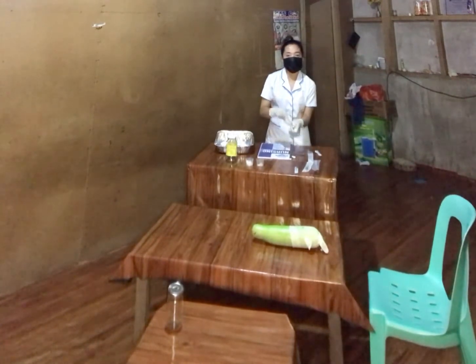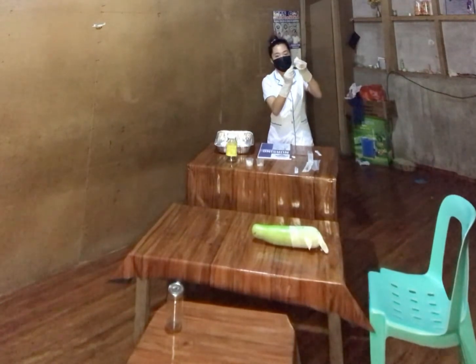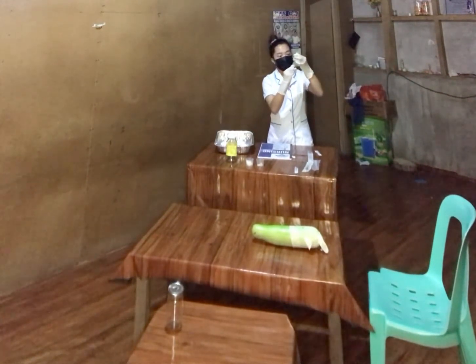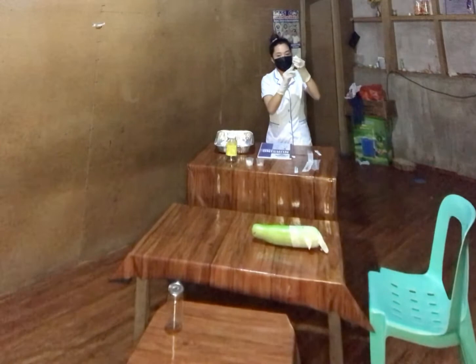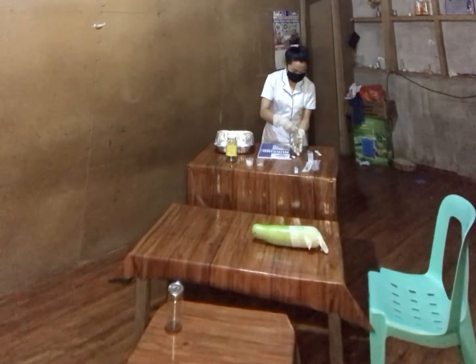Then invert the vial and draw the expected amount of medication needed. Tap the barrel to remove the air bubble.